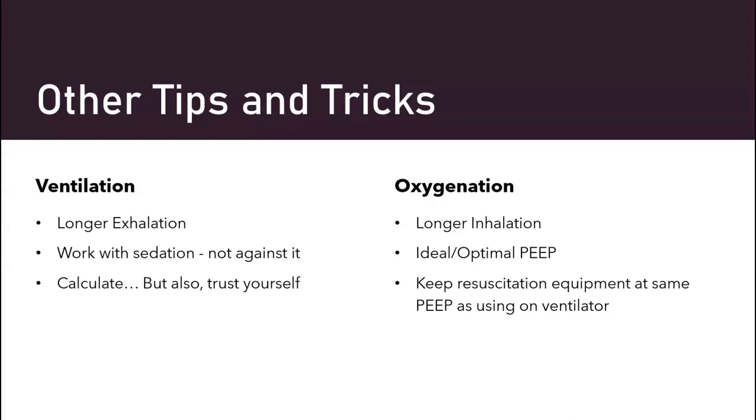Sounds great. Whereas if they want them extubated as soon as possible, I'm like, let's do this. Wake them up. Let's wake them up, get them on pressure support, and get them extubated. So talk with your team, and that helps a lot with ventilator synchrony and appropriate ventilation.